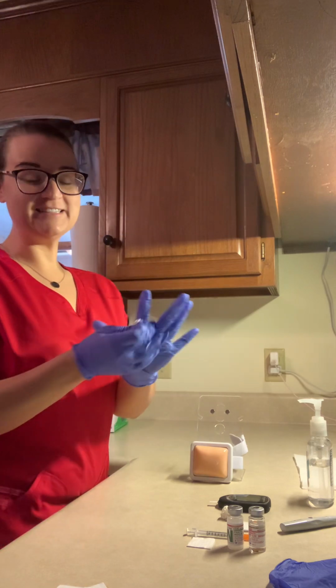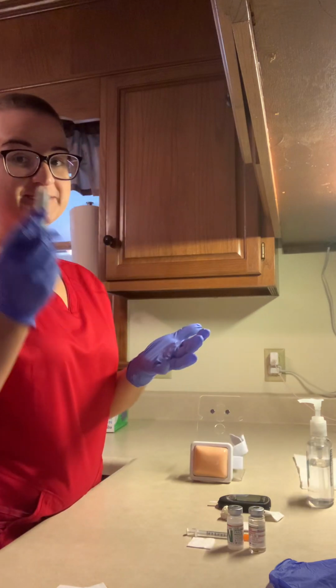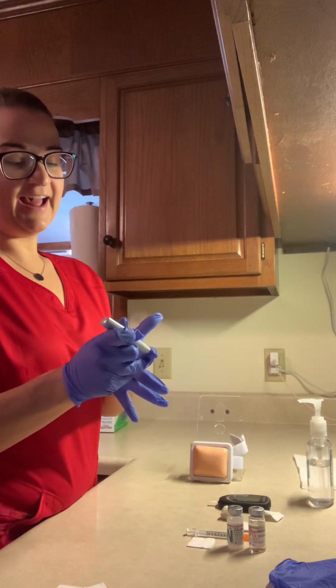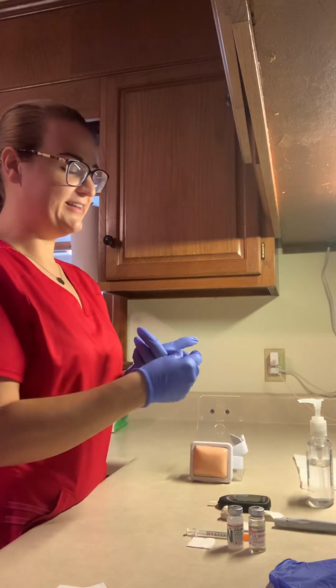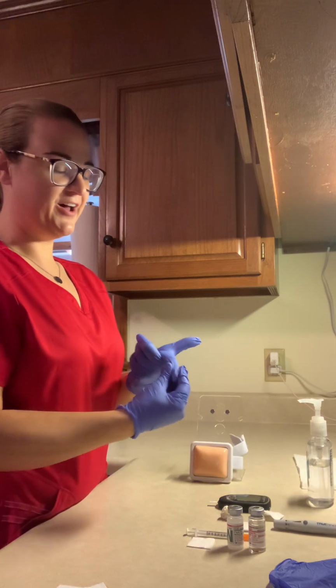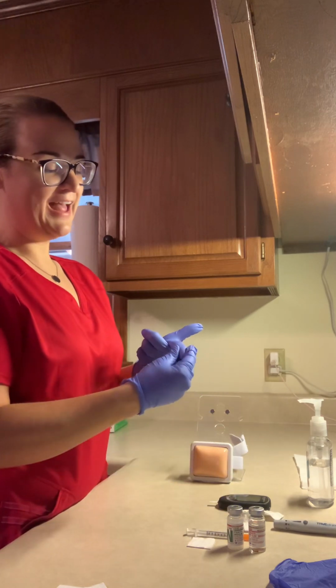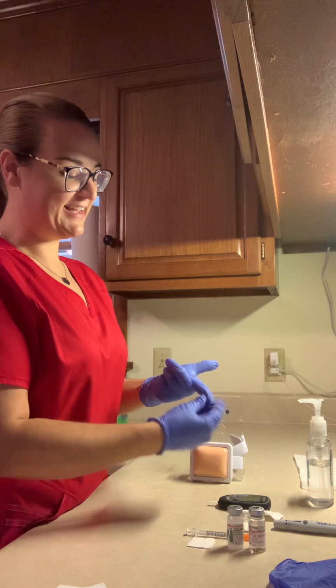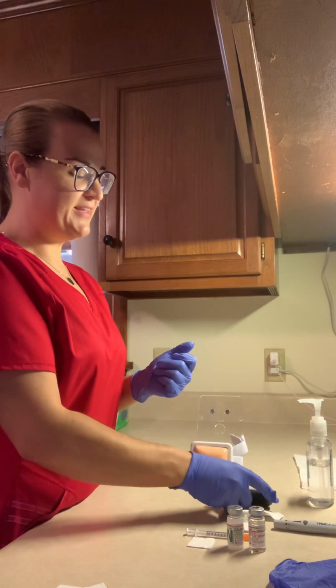Using myself as an example, I would clean the fingertip and, using a single-use lancet device, I would place it flush against the skin, press to allow the needle to insert, drawing up one drop of blood and wiping it off with a clean cotton ball, and getting that second drop of blood to test on our testing strip.